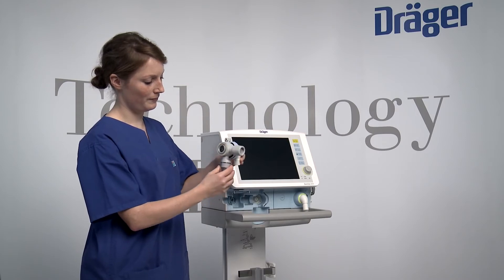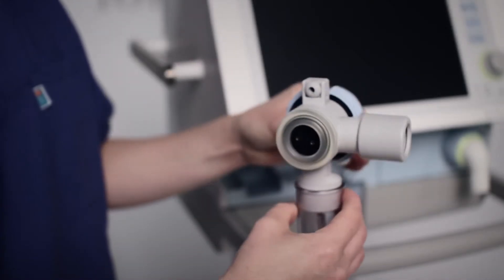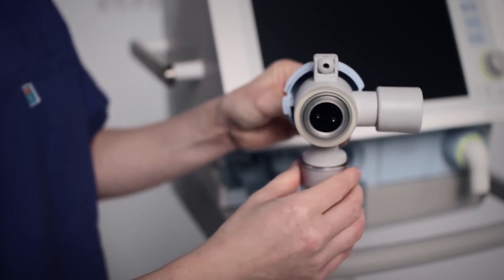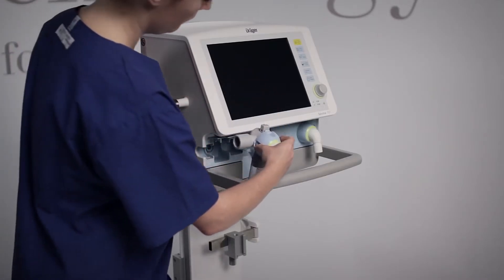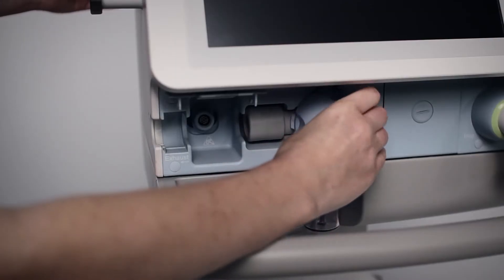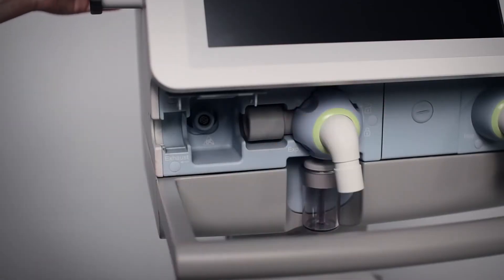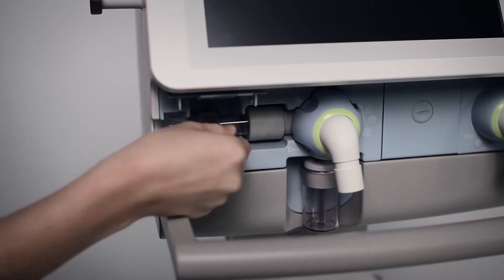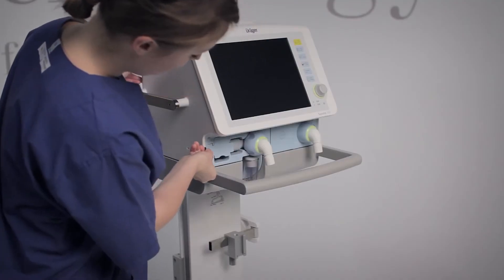Prepare the expiratory valve. Check that the diaphragm fits properly onto the edge of the expiratory valve housing and that the flow sensor sleeve and the water trap container have been attached. Then insert the expiratory valve. After that, insert the flow sensor and push it up to the stop in the flow sensor sleeve of the expiratory valve.